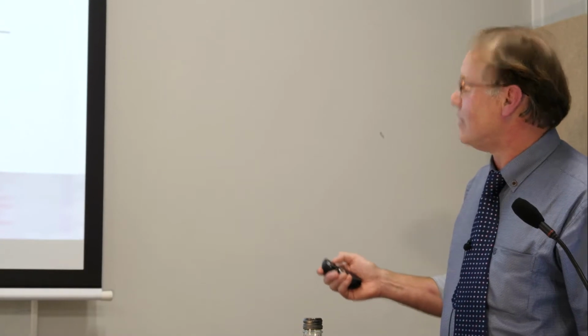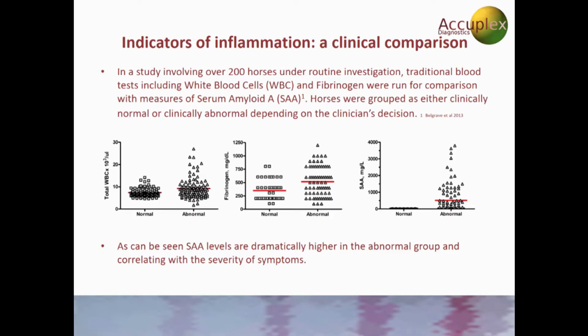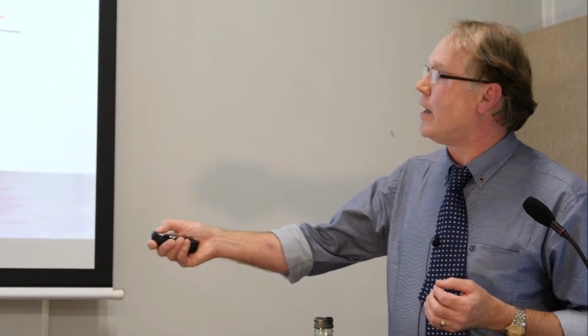Now, on the right-hand side, we have serum amyloid A. And you can see here that the level of serum amyloid A is actually very, very low. And it's non-existent in some horses, but it can rise to maybe 15, 20 microgram per mil. But on the right-hand side, you can see where there's an inflammatory condition, it's gone up significantly. And while you might have some horses where there's no response there, likewise in here, there may be no inflammatory condition. Where there is a problem, the SAA is now giving you a very, very clear-cut result. So it's actually adding information that these two here may not be giving you.